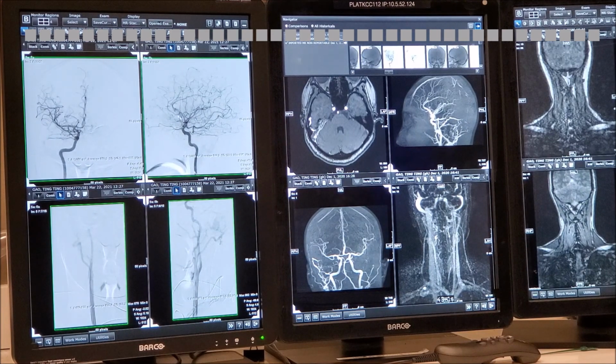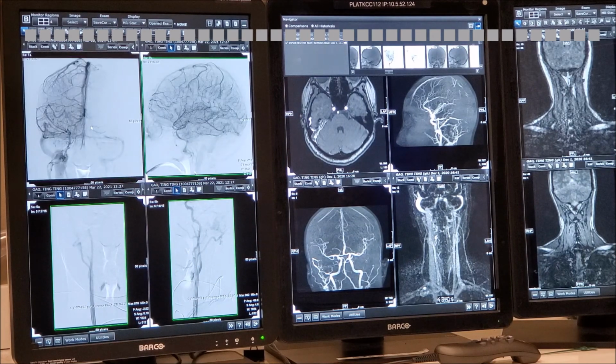Okay? You're also making a lot of cognitive connections. For example, very good, PCOM, right? Yeah. So you have to start thinking about those things. Now we're going to try to see the late venous phase. There you go. Here you see the drainage of the supratentorial circulation shows you that sinus, right? Yeah. And now we know, because of the contrast, that the fistula is from here down.